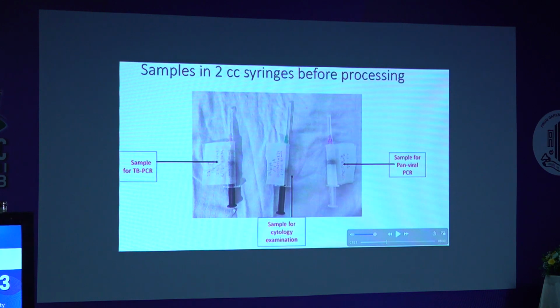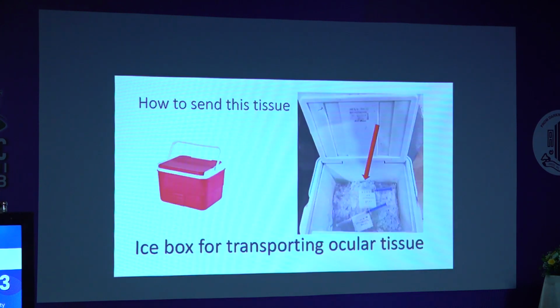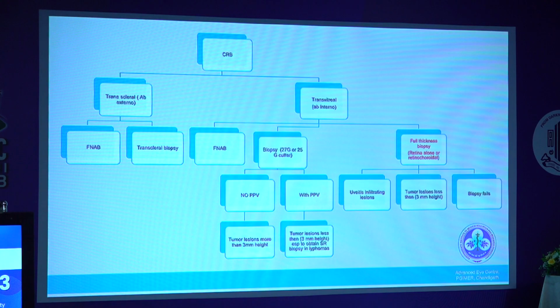And of course, before taking the samples, you should know where all they will be going. So they should be labeled and put in the ice box if you're taking the cytology samples, and then sent to the person concerned, because he is the most important once you have taken the samples.